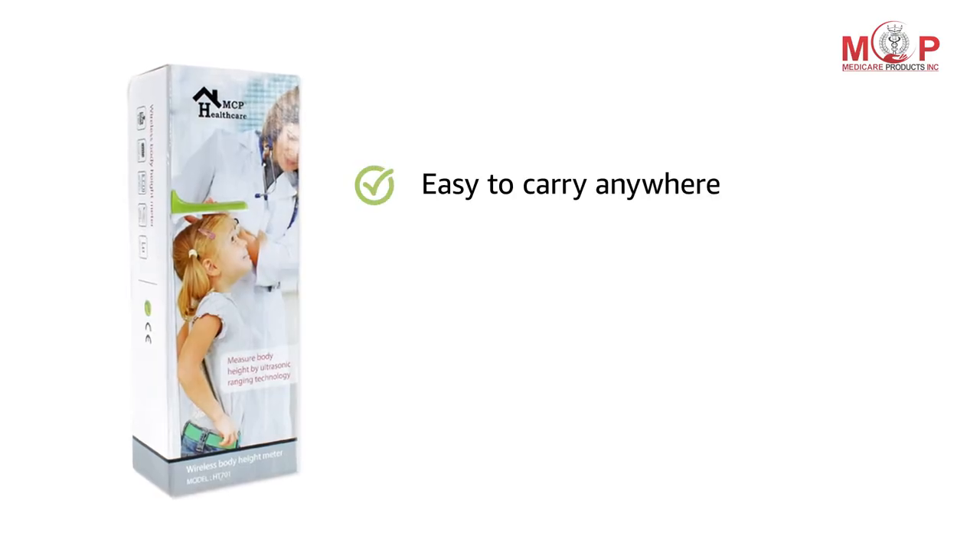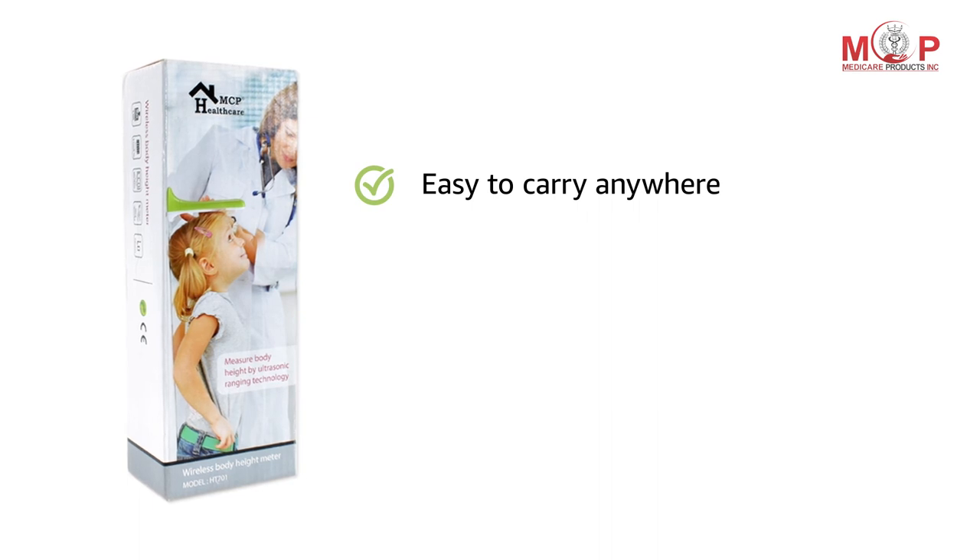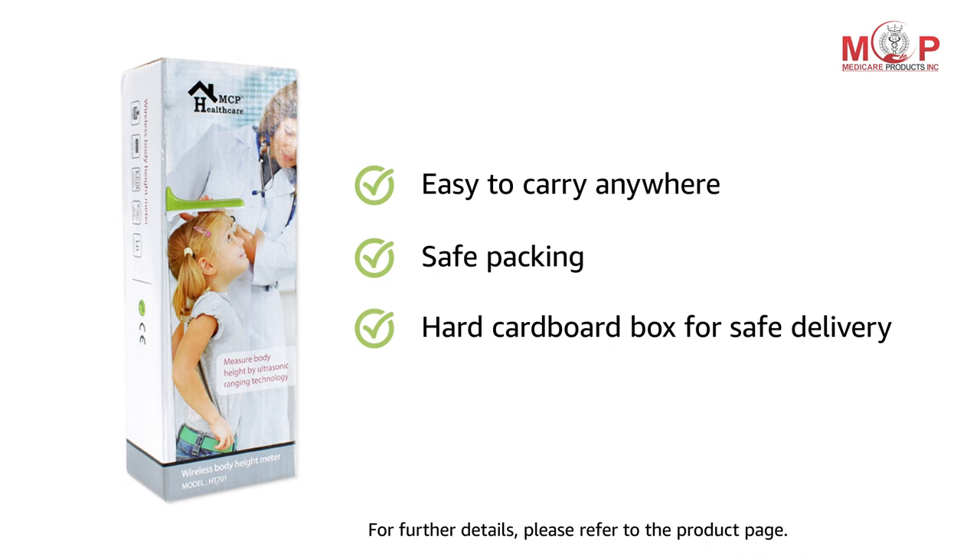The compact size of this device enables you to carry it anywhere you want. It comes in a hard cardboard box packaging for safe delivery.